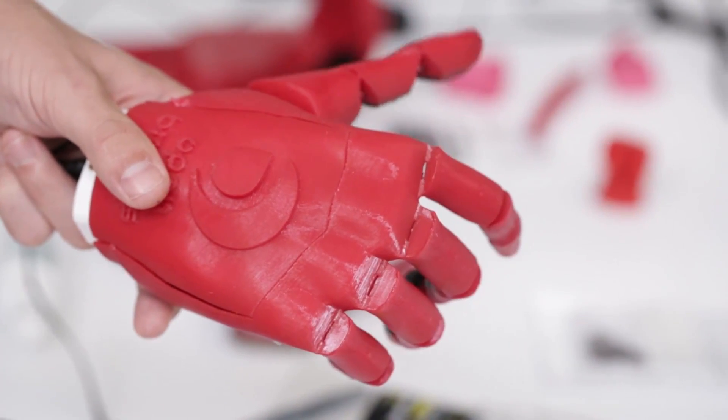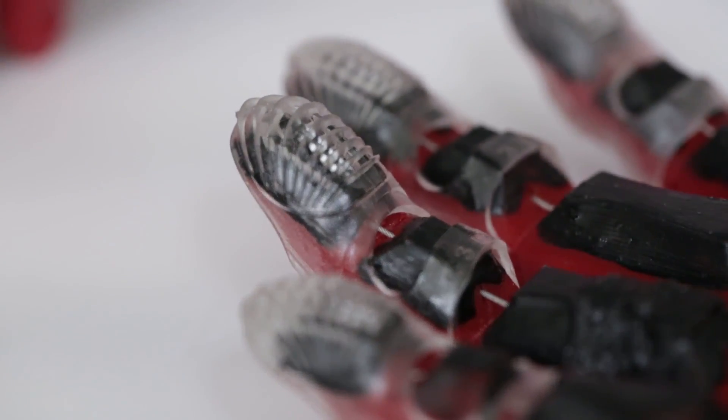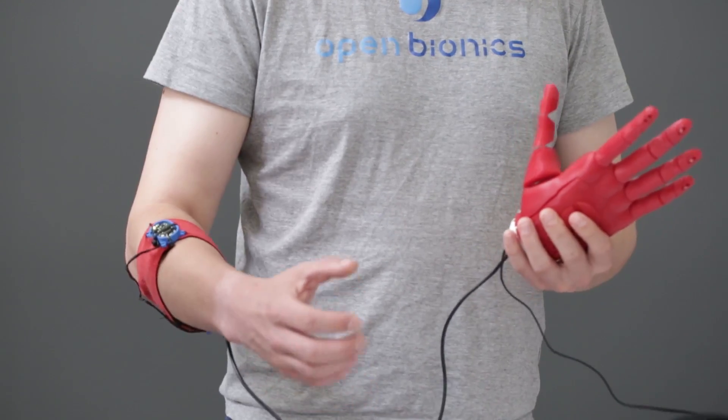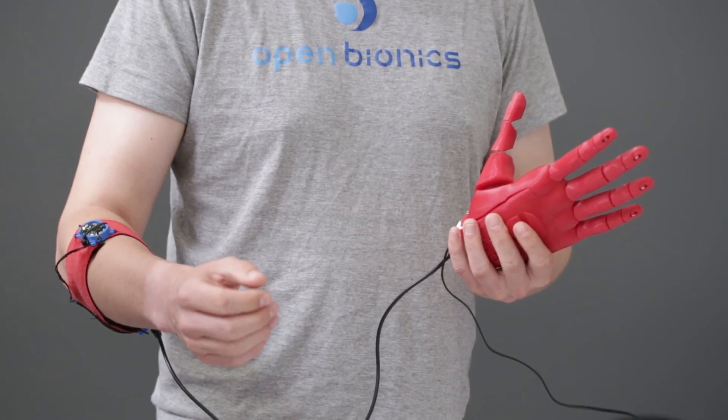Open Bionics creates open-source 3D prosthetics activated by internal strings. The devices are simple, but the complexity is in how they're controlled. Using myoelectric sensors, the prosthetics use forearm muscles to open, close, and grip like a living hand.